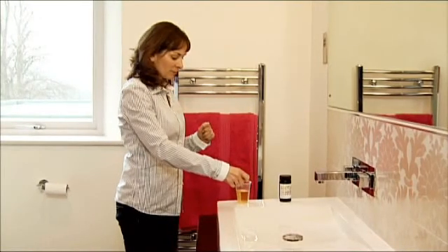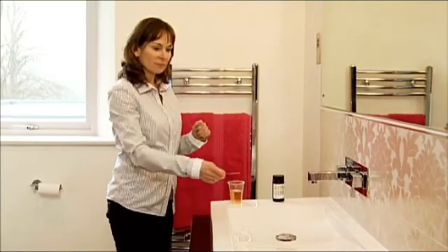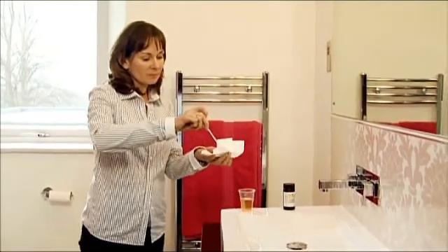Take the dipstick out of the plastic cup, running the side of the stick along the top of the cup to remove any excess, and then touch the end against a paper towel to avoid drips. Now wait another minute for the chemical tests to develop.